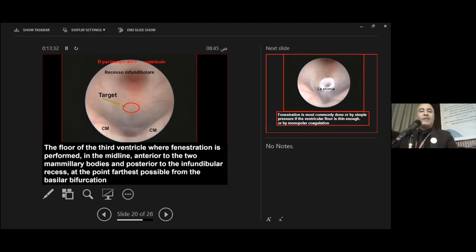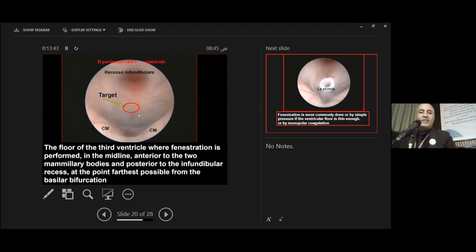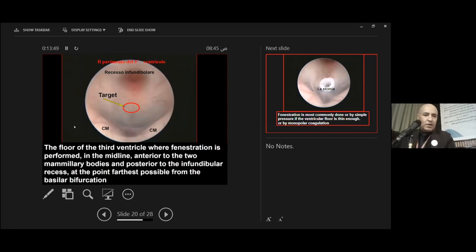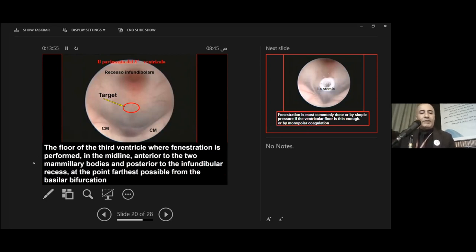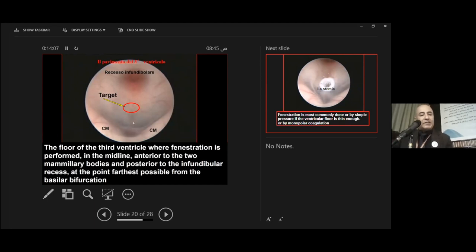This is the floor of the third ventricle, our target here. We have the mammillary bodies here, and this is the target. This is the infundibular recess. The floor of the third ventricle where fenestration is performed is in the midline, anterior to the two mammillary bodies and posterior to the infundibular recess. This is the point farthest as possible from the basilar artery.